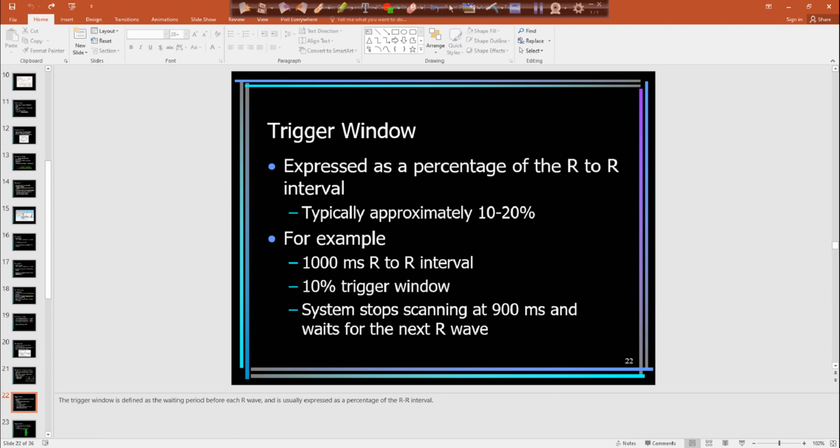As you hook up the electrodes, ideally at 60 beats per minute you would want a peak R wave almost every second. But that doesn't happen. Usually we get one, and then maybe the next at the next second, but then it waits 2 seconds, and then 0.5 seconds.